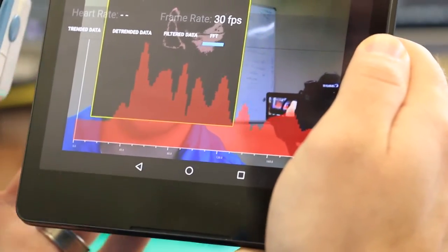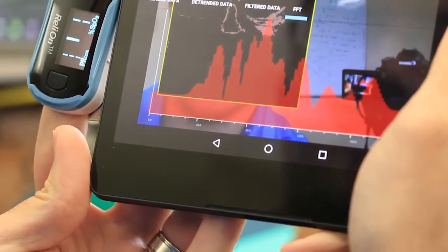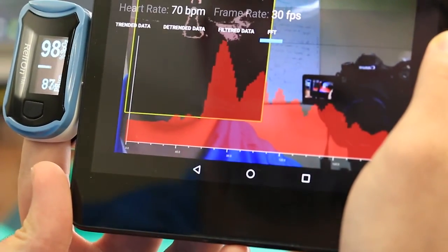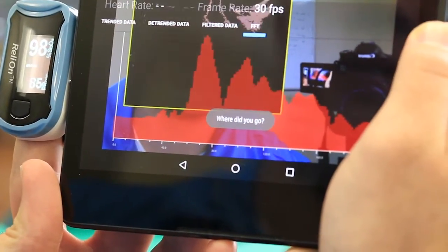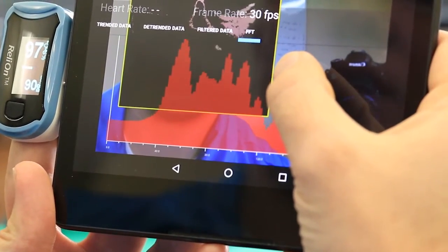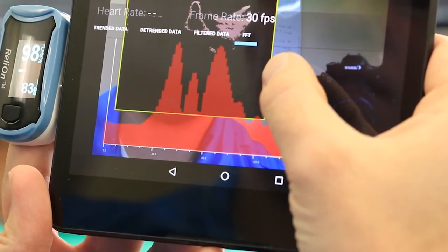Over here I have a pulse oximeter that I've just placed on my finger. I'm going to try and get both of these in the scene. I hope you can see that. And now I'm showing my heart rate. It's pretty high, probably because I'm making this video.